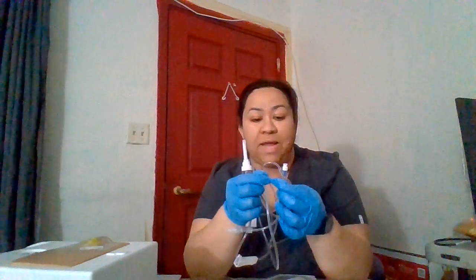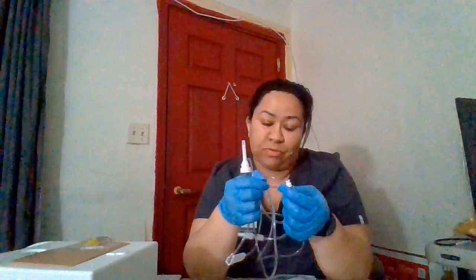The Y connector is meant for any bolus or IV push medication, or also in this case, a secondary line, so piggyback. We will be using this part. We need to verify whenever we use the Y connector that the medication that we are going to be administering is compatible. And the last part that we have here is the adapter. The adapter is what is connected to the patient. So it'll be the part that gets connected to the patient's IV site.